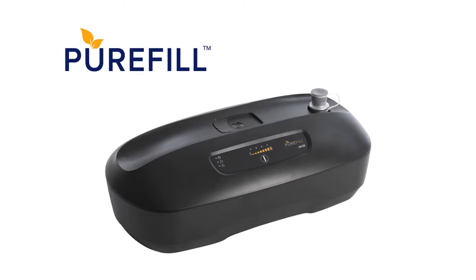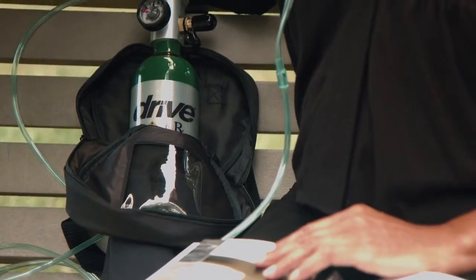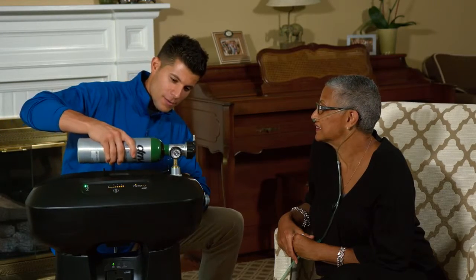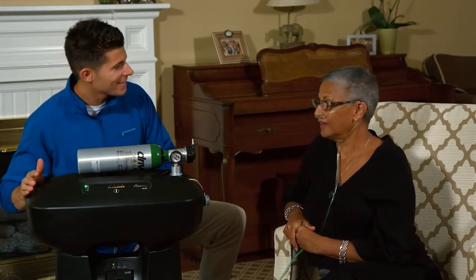The PureFill is designed to fill your compressed gas oxygen cylinder for portability and freedom inside or outside of your home. The PureFill works in conjunction with an Oxygen Purity Sensing Concentrator, so you're able to fill cylinders yourself rather than wait for full cylinders to be delivered, leading to an even more independent lifestyle.